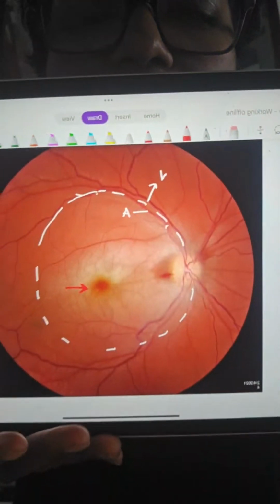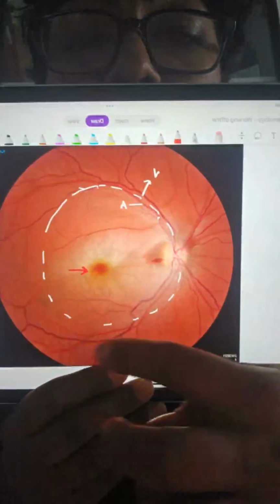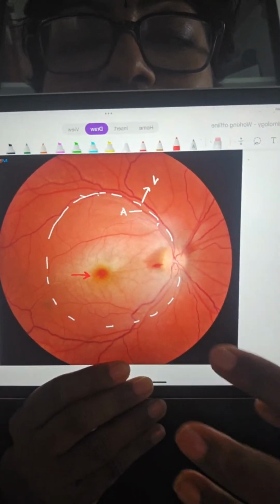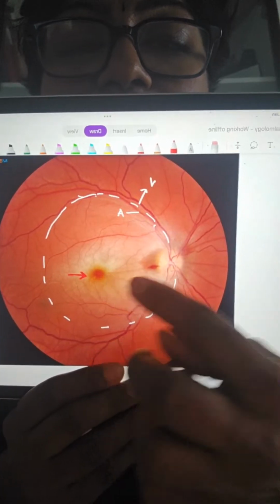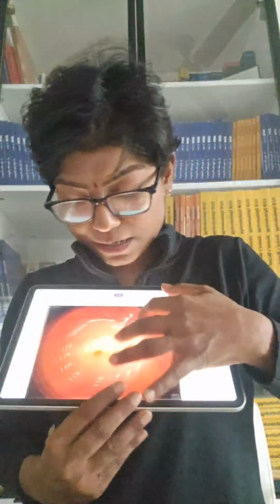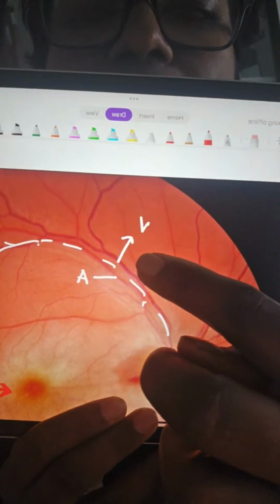One last time, let's take a look at our central retinal artery occlusion. That is your right-sided fundus, because my optic disc is here. This is my macula and my macula is pale. I would want to call it milky white retinal edema. And there is a cherry red spot, and I want you to see the arteries and the veins. The vein is a little darker and thicker.